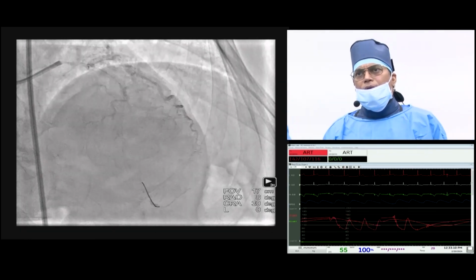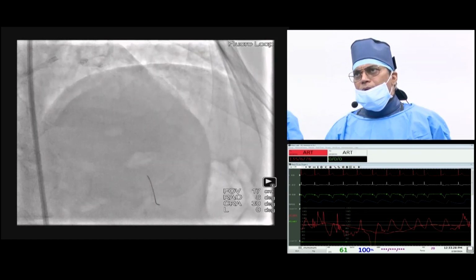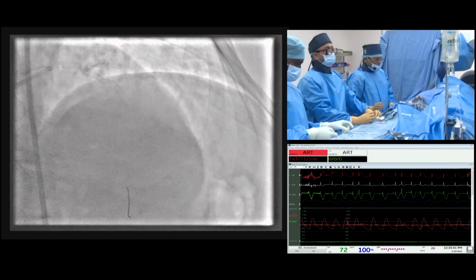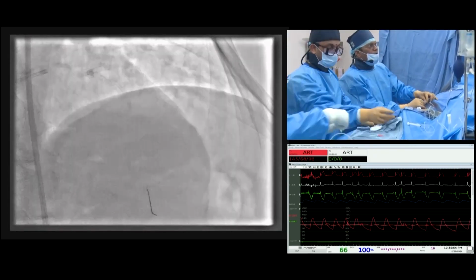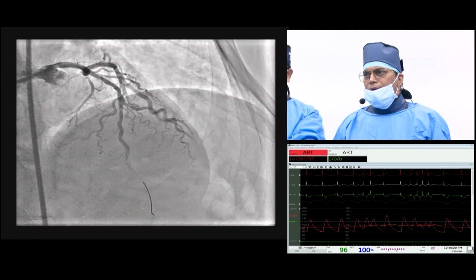Improve the flow, then you proceed. Distally, don't use the 120, only 80,000, 1 mm per second. You can see mild ST elevation. We'll try to give a small dose of NTG. Now you can see the ECG, ST changes significantly regress.